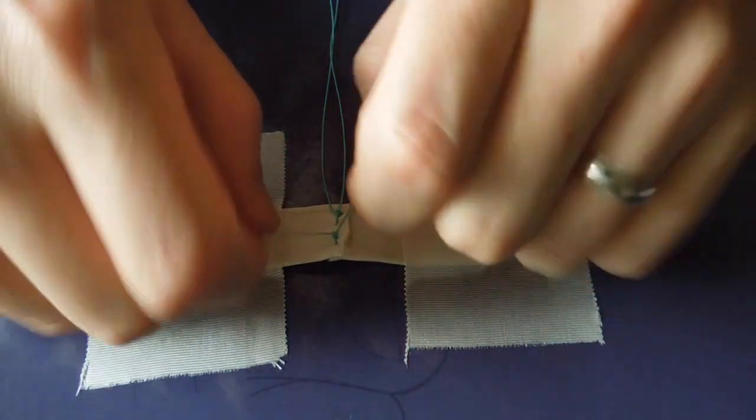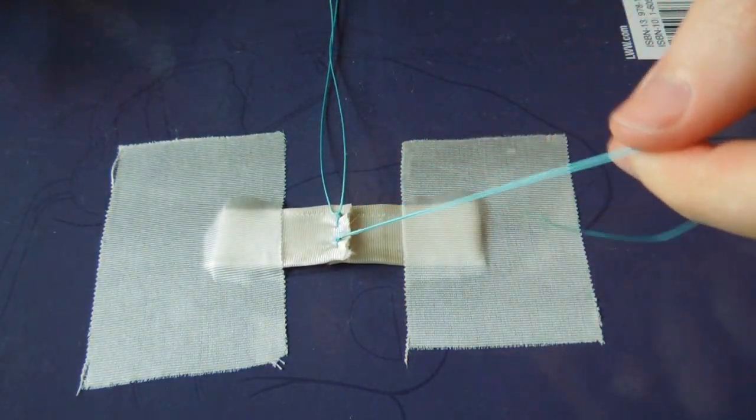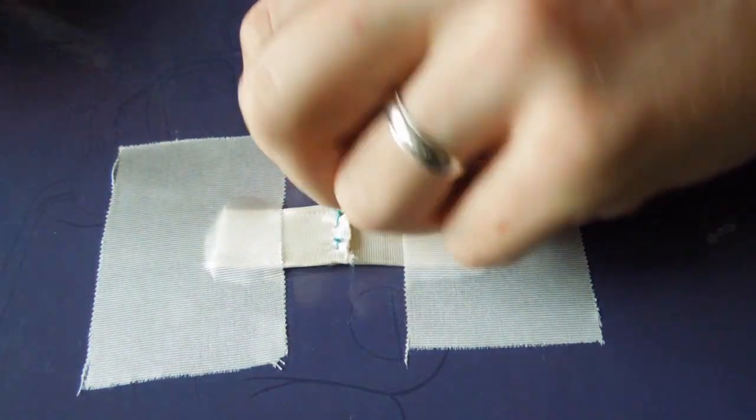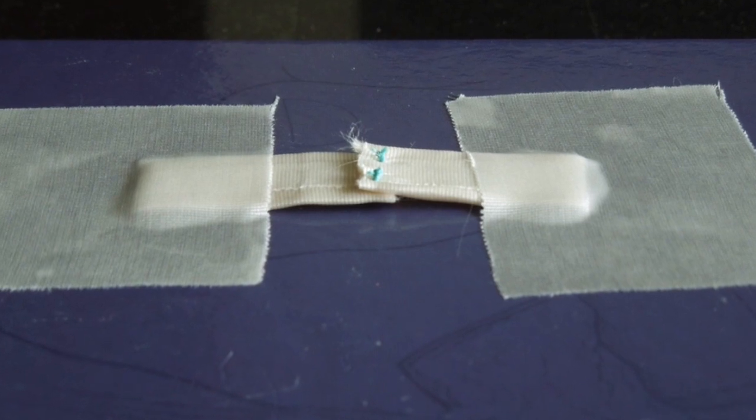So we've thrown our hand ties, we cut our sutures to just above the knot, and we have completed our pants over vest sutures. And you can see the overlap here of the sides.